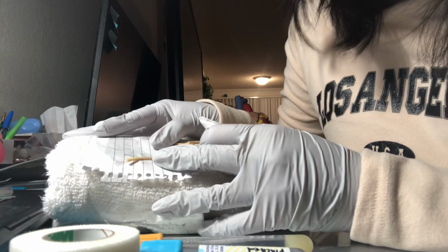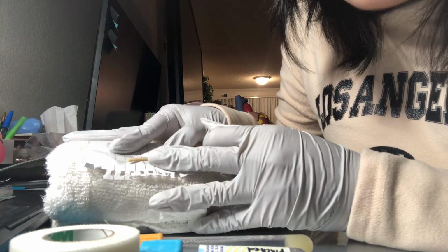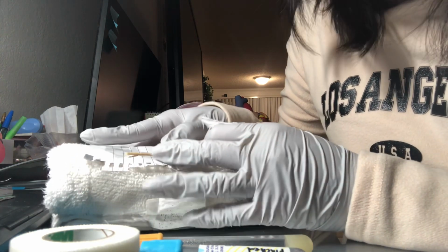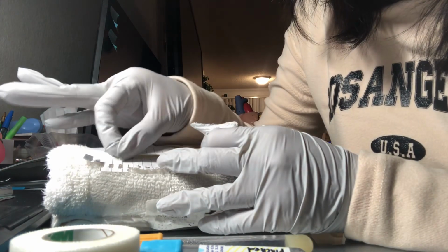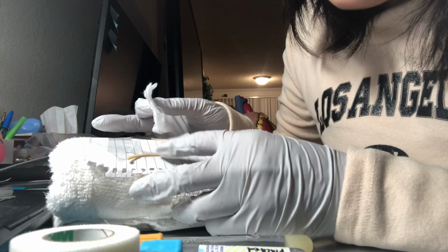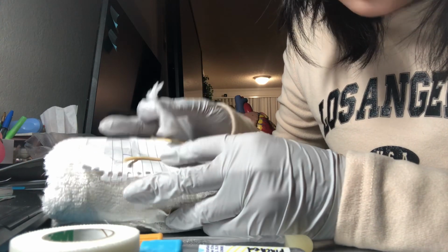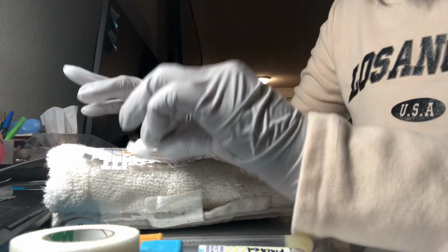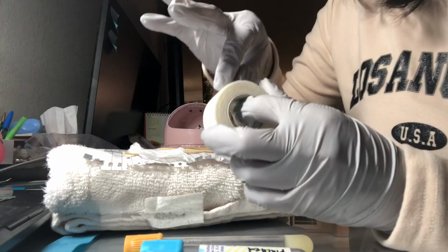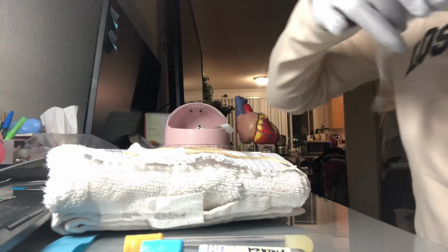Because after 20 to 40 seconds, the site is supposed to be clotted with a bead of blood. So I check and see if everything is in good condition. The bleeding has stopped, and then I will finish the venipuncture by sealing the site with the medical tape.